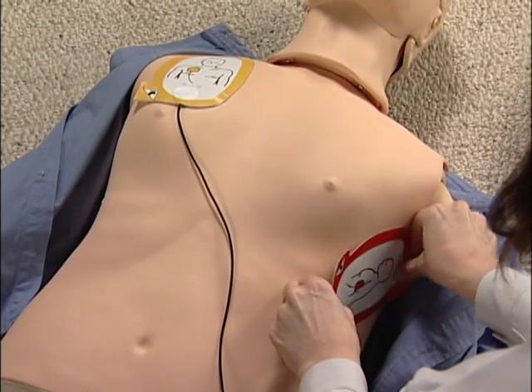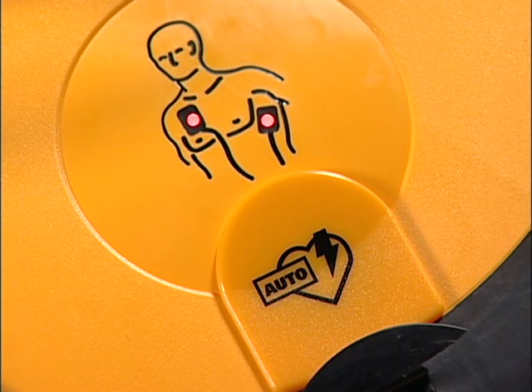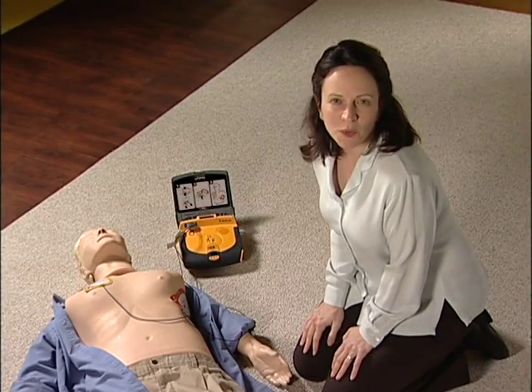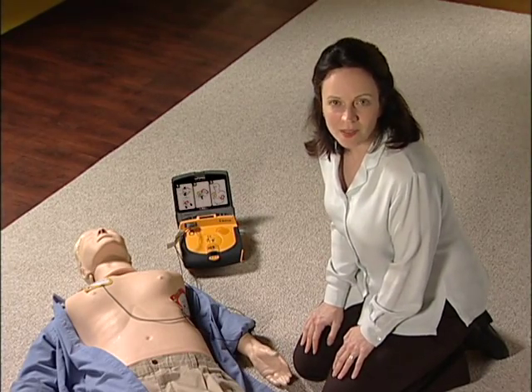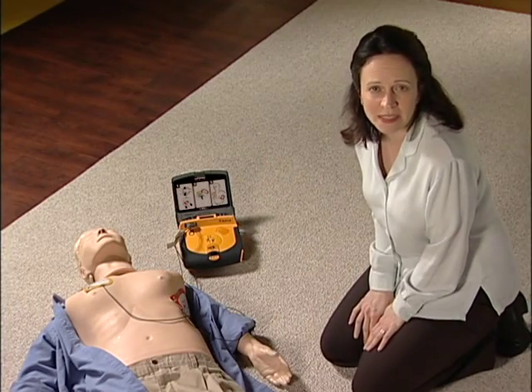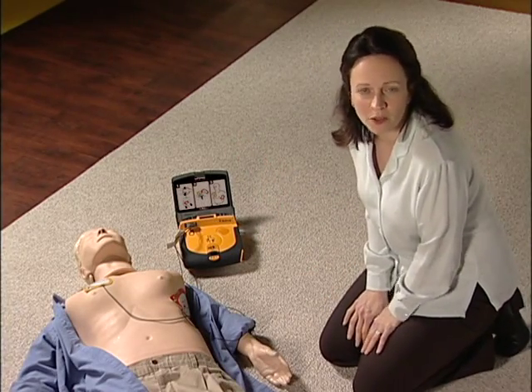As soon as the pads are in place, these lights turn from red to green, and the LifePAK AED immediately starts to evaluate the heart rhythm. Do not touch patient. Evaluating heart rhythm. It evaluates the heart rhythm within 11 seconds. Stay clear until it finishes. If you touch the patient or the AED now, you might interfere with the evaluation.